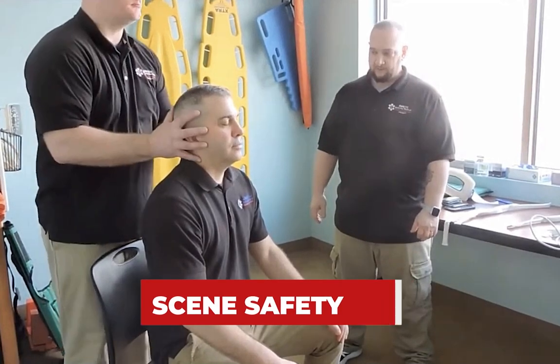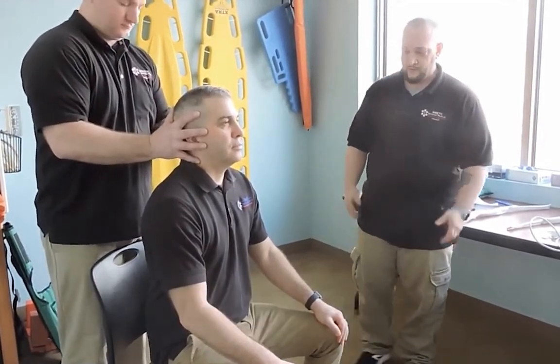Scene safety, BSI. I'm going to direct my partner to take inline immobilization of the C-spine. Make sure you keep them in a neutral position. I'm going to introduce myself — sir, how you doing? My name is Joe with the ambulance company. You okay if I check you out today? Yes. Okay.